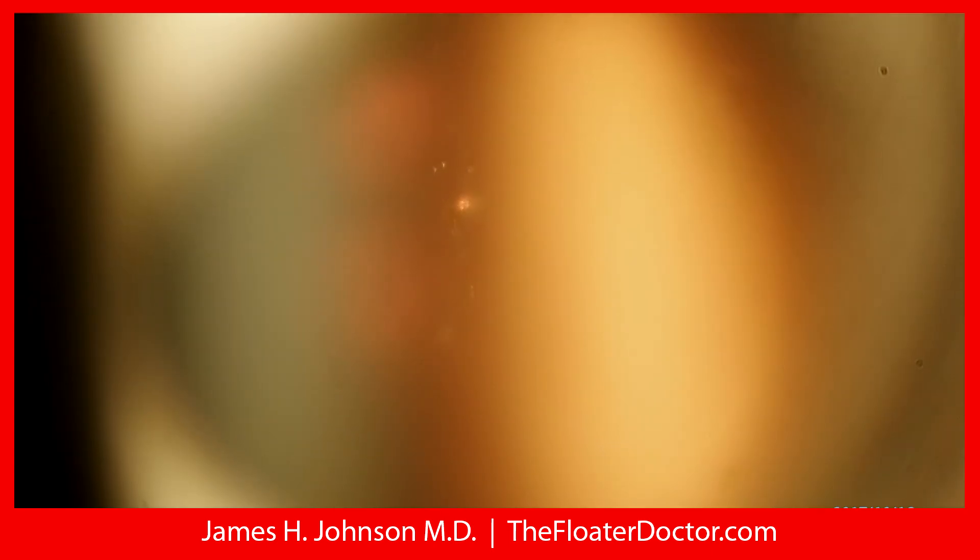I'm going to stop the video and jump ahead a few minutes, because watching every shot of the laser is like watching paint dry. Now I've jumped ahead maybe three or four minutes, working in the same area with the same lighting. We're just picking at some small residual bits and pieces. Even to the untrained eye, these little creamy-colored bits and flecks are significantly reduced from the original. One of the nice things about the optics of floaters is you don't have to have 100% perfectly clear vitreous to have a happy patient — you just have to get the big stuff. Small bits far enough away from the retina won't cast shadows and generally won't be seen by the patient.